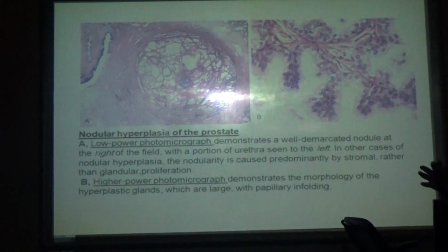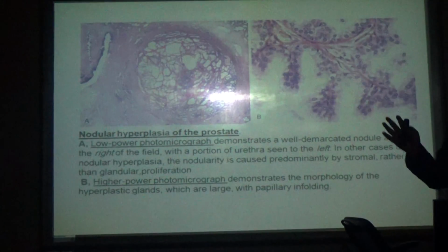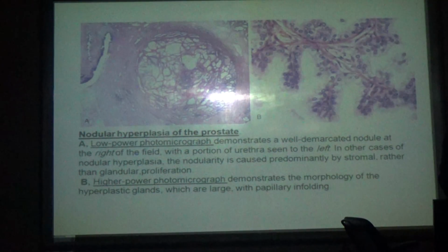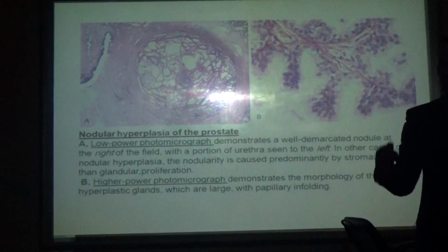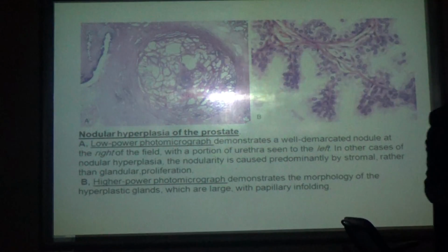Some glands or ducts secrete secretions, and those glands are lined by double-layered epithelium. For example, the salivary gland and breast tissue. These are all helpful in ejecting the secretions from the epithelium into the lumen. That's why the double-layered epithelium is helpful. You will be discussing the same topic in breast. Maybe Dr. Mavi will be talking about the breast, right?